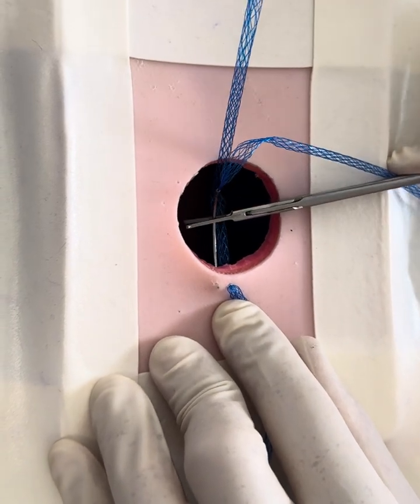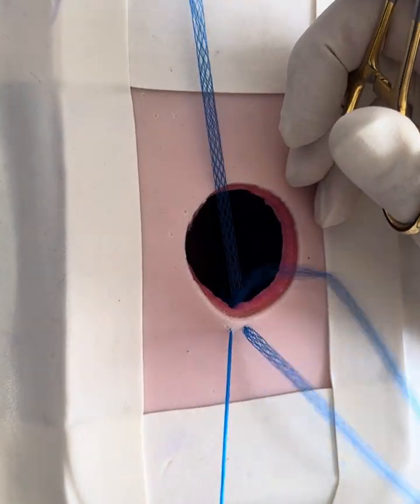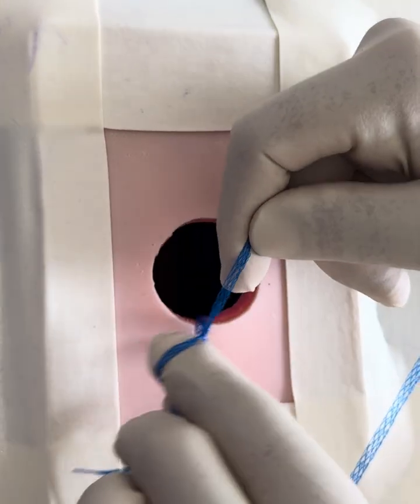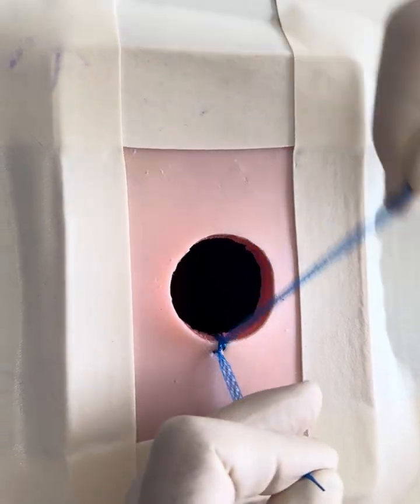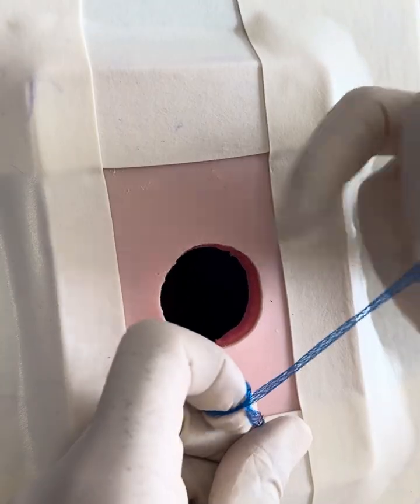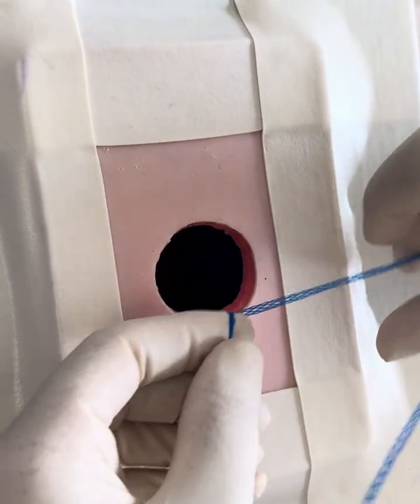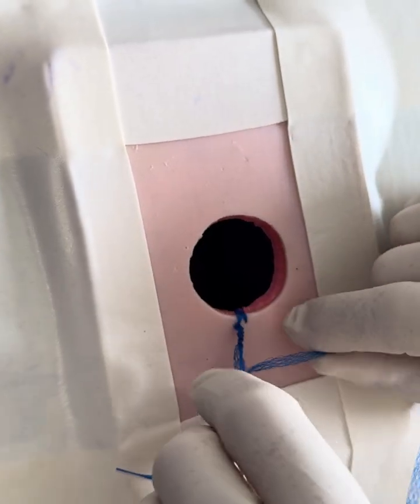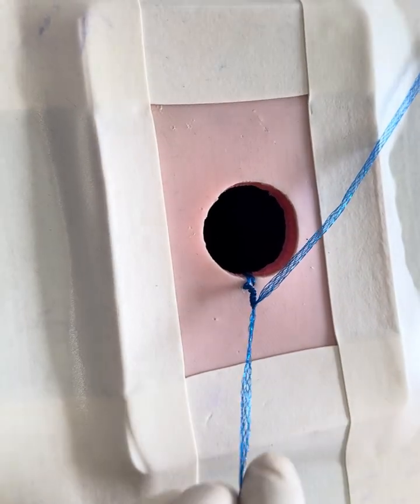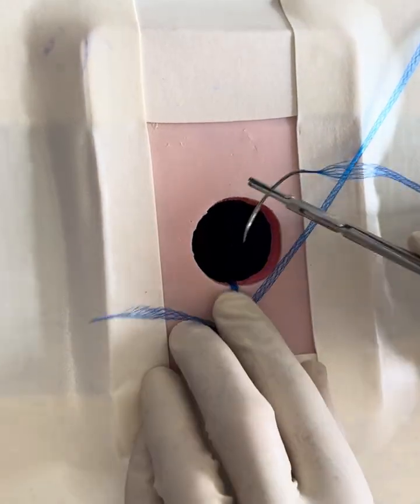So second bite close to the first bite, and then it doesn't matter, hand tie, instrument tie. And the beauty with Duramesh, as everybody that uses it knows, is you don't need to rip it tight through the tissues. You get better ingrowth of collagen by just tying it snug but not tight. And then I always find 8 to 12 throws anchors it nicely, and then we start the mattress suture.